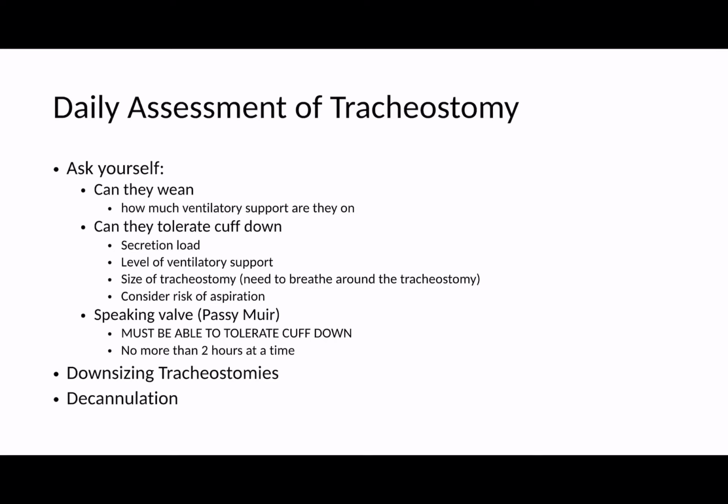Now, if that all sounds like gobbledygook to you, don't worry. The next set of videos will be talking about ventilation, and you'll start to understand a little bit more about how you can use the ventilator to reduce the amount of resistance in the circuit and reduce the work of breathing for patients.